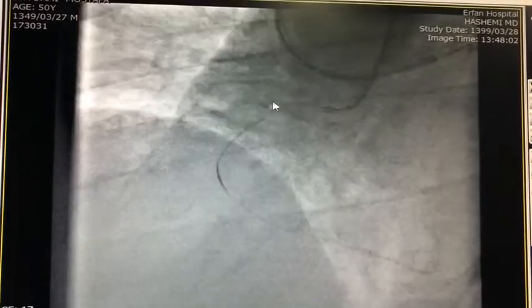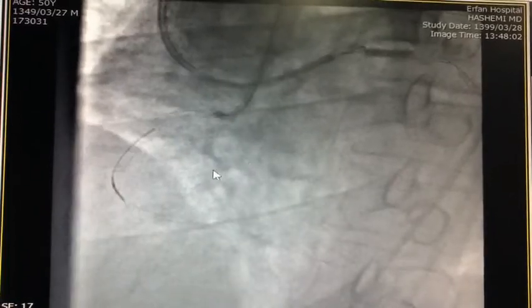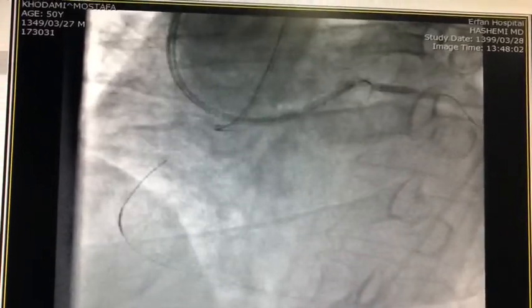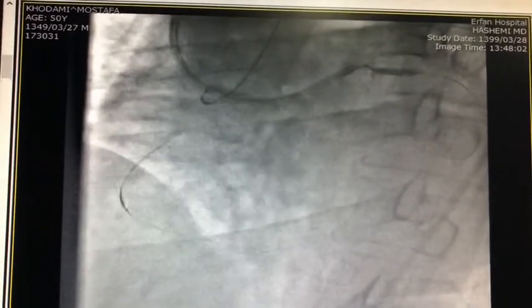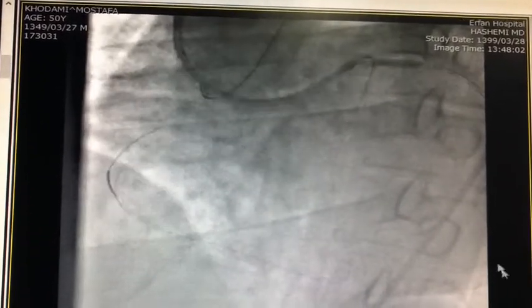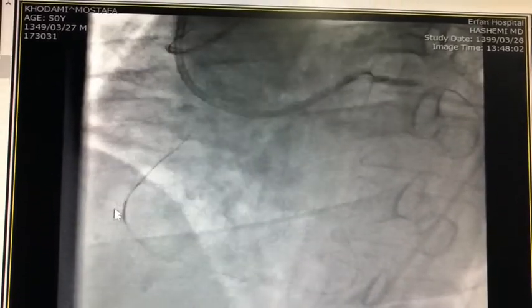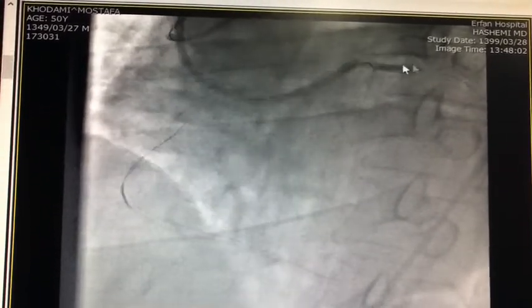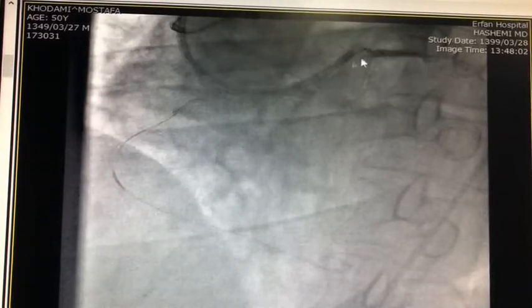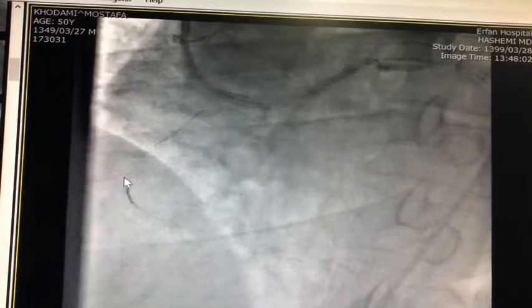We managed to get into the aorta, but we were in subintimal for sure. So we withdraw and try it again. And after about 20 minutes, we managed to finally get the retrograde wire into the aorta. This is Turnpike LP. As you can see, it's advanced very nicely, and this is the anchor balloon in the ramus. And you can see that we deepened the guiding as far as we could to get more support.